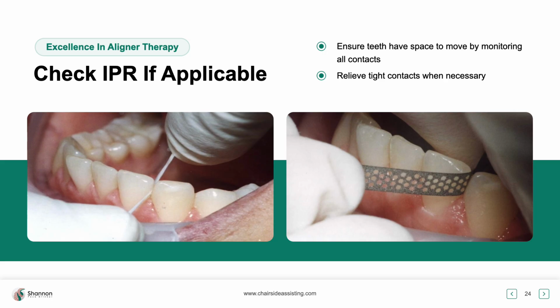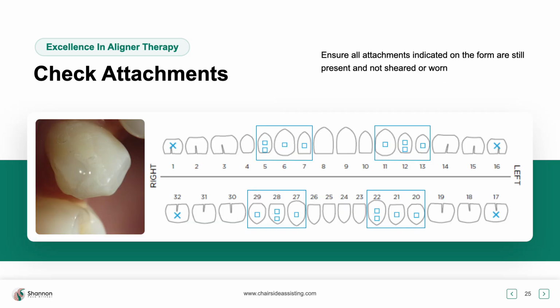I want to let you know, because remember, we're Invisaligns. We are not just a team member slapping some composite. We are doing a very serious procedure for these patients. We're moving teeth. And when we think about putting pressure on the teeth to have that movement, I want to make sure I'm letting my doctor know any area, because if we don't have space, we will not have movement. And sometimes they got to go back in with our contact ease and relieve some of the areas interproximally, just because of those contacts, making sure things are where they need to be.